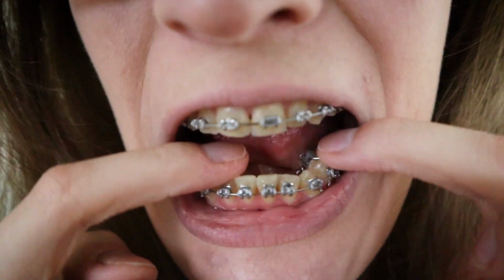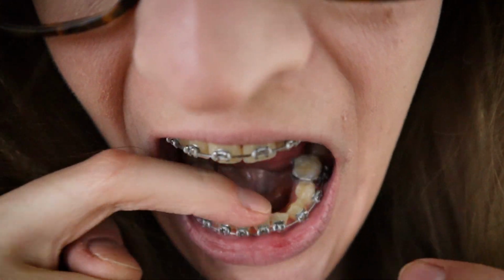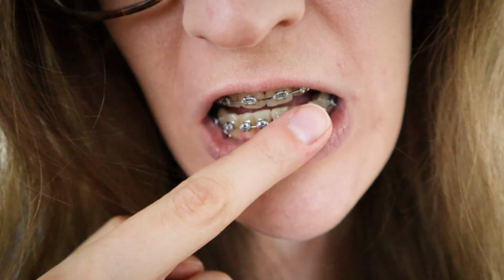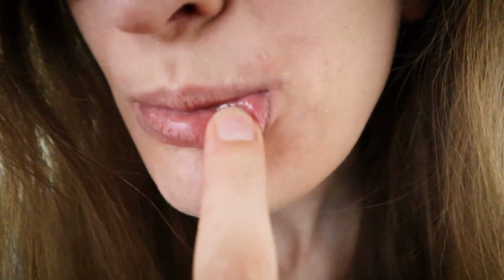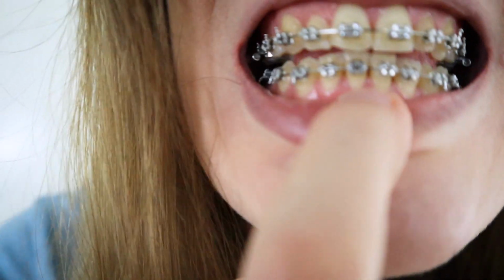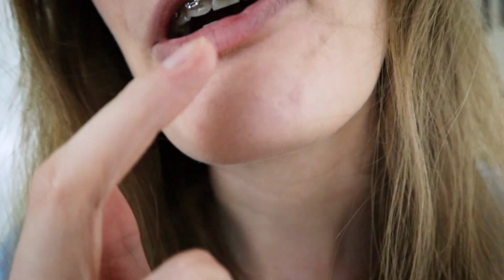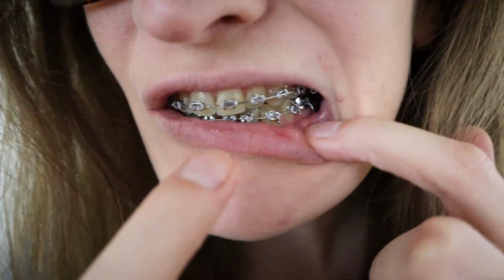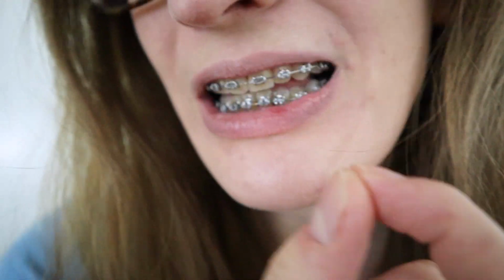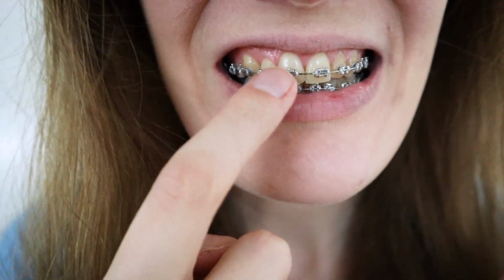And yeah, so here, you can see that we're just trying to pull this one out, to turn it so that it'll line up. And right now there's this space here and here, and then also a little space here, and then of course that one up there, but we're not doing anything to the top right now. And the goal is to get this to move into place and then get a thicker wire on here, and I think once the bottom wire is as thick as the top, then they'll probably start moving the top a little bit too. But right now the focus is just on the bottom.